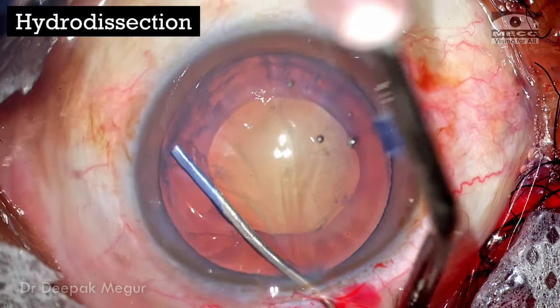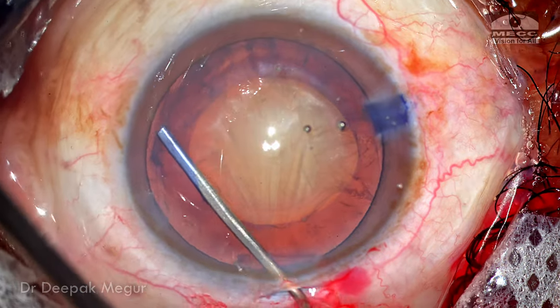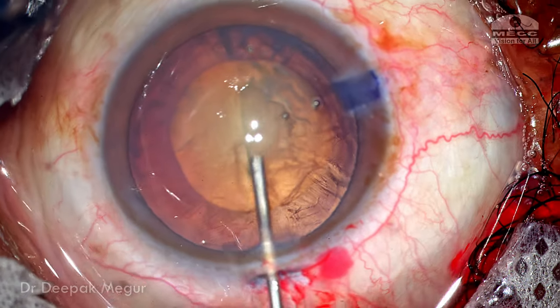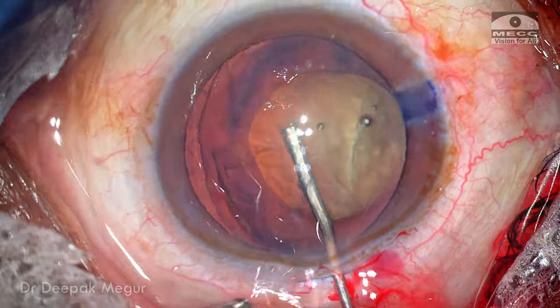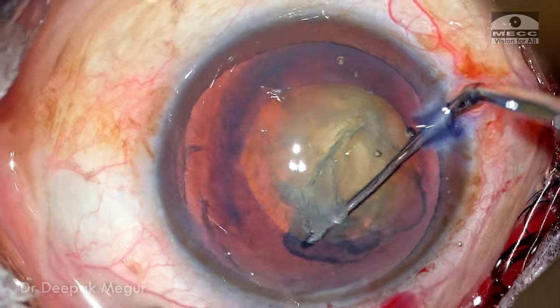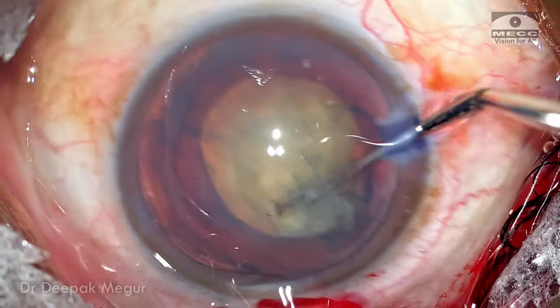I'm going to perform gentle hydrodissection. You can see this gentle wave confirming cortical cleaving hydrodissection. The nucleus is pushed down at the opposite pole to let the fluid escape out of the capsular bag, ensuring the bag is decompressed. The nucleus is then rotated gently using a lens hook, confirming that the cortical-capsular adhesions are well and truly broken.